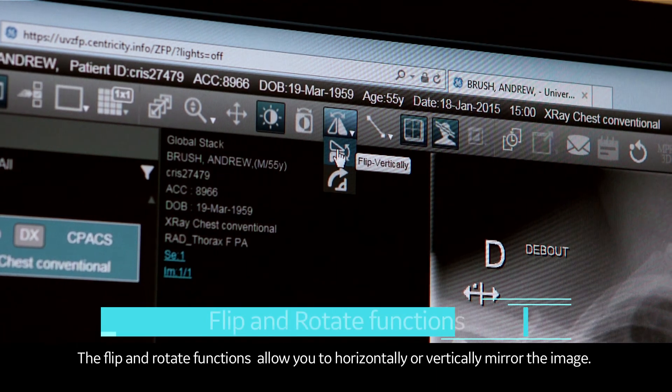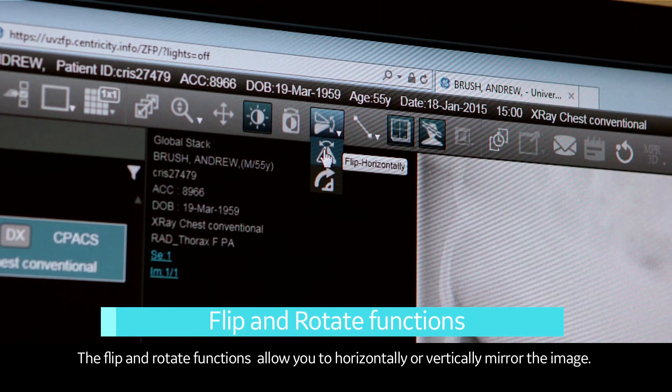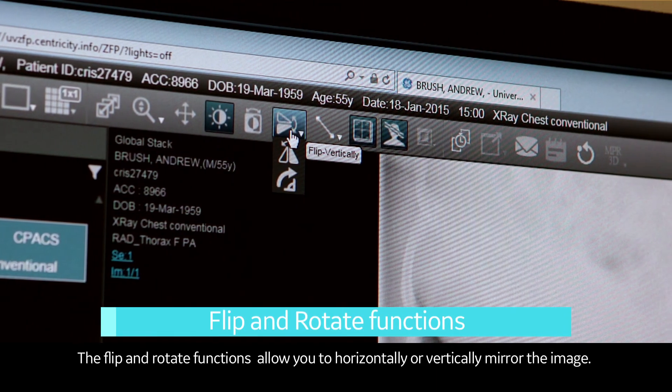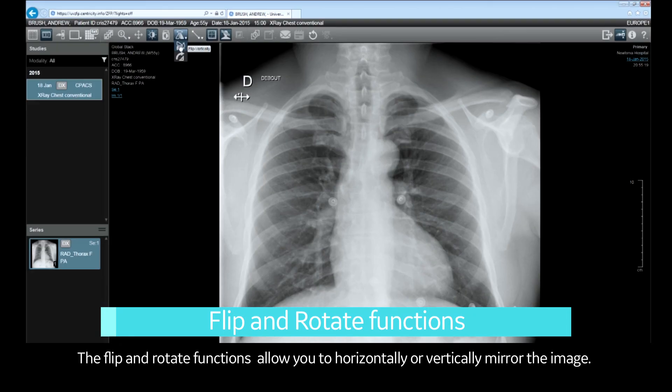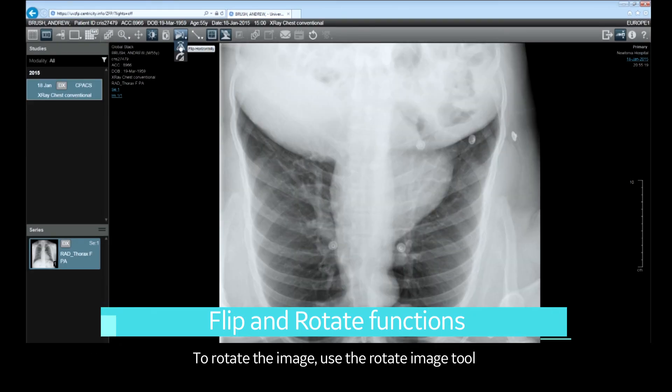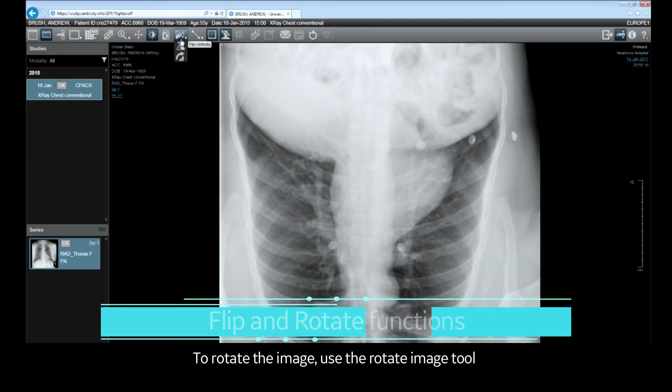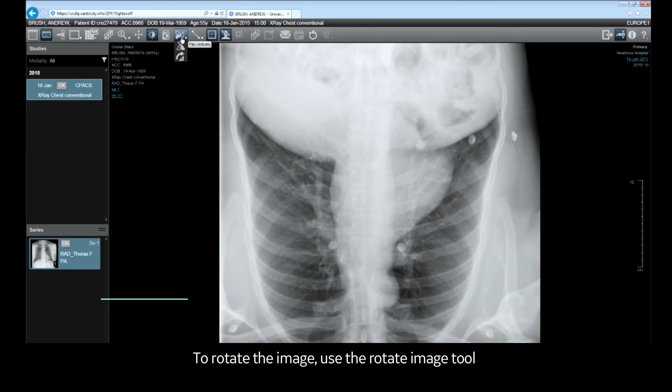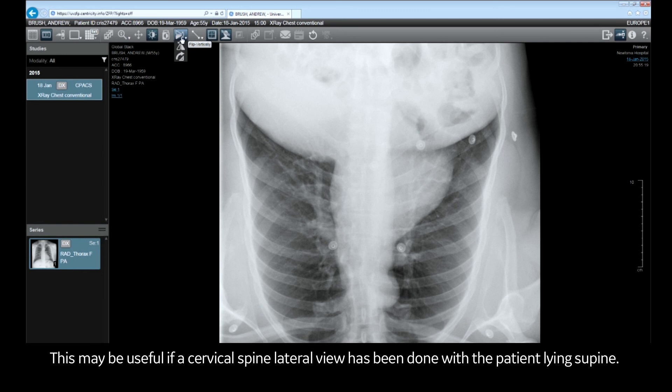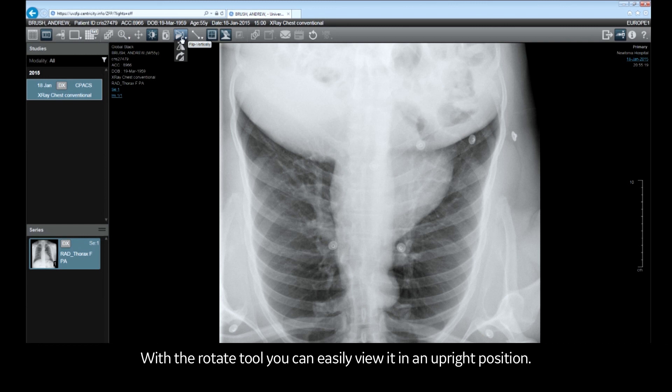The flip and rotate functions allow you to horizontally or vertically mirror the image. To rotate the image, use the rotate image tool. This may be useful if a cervical spine lateral view has been done with the patient lying supine; with the rotate tool you can easily view it in an upright position.